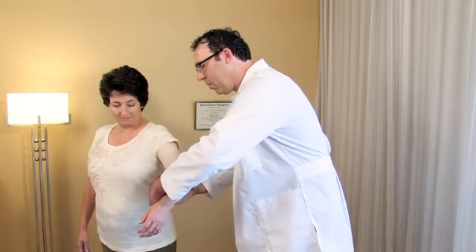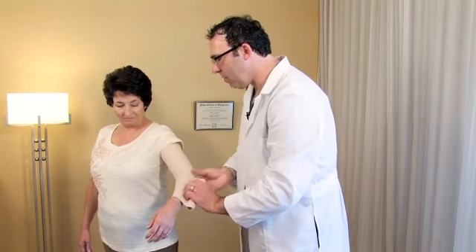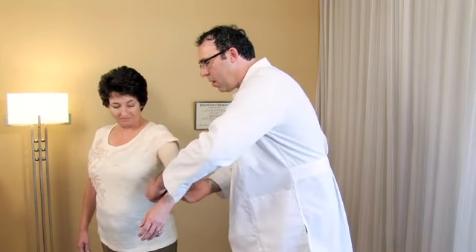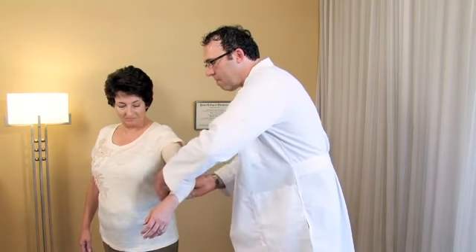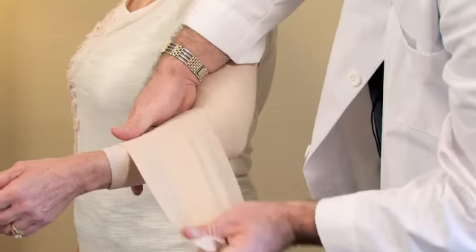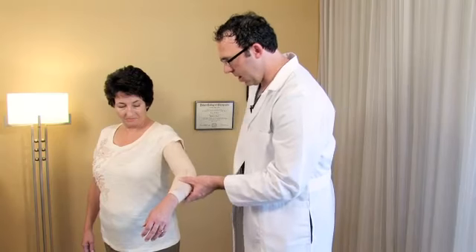This is really going to help to put a slight bit of pressure on the musculature in the elbow. If there's swelling, it's going to help to push the swelling out. It's going to help to support the ligaments and muscles and just allow your elbow to feel a lot better if you have a strain.